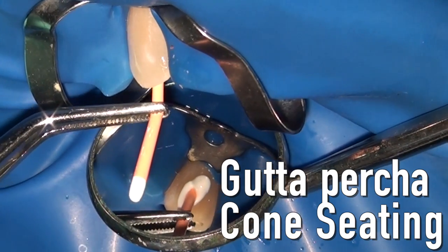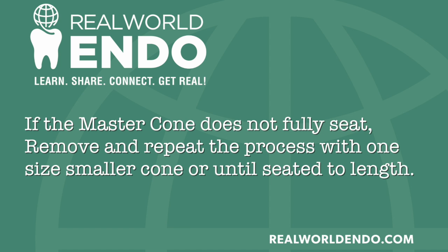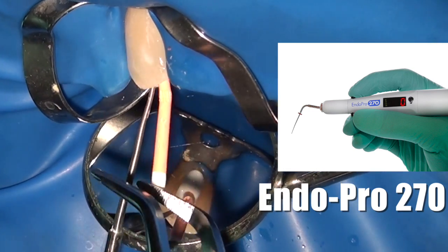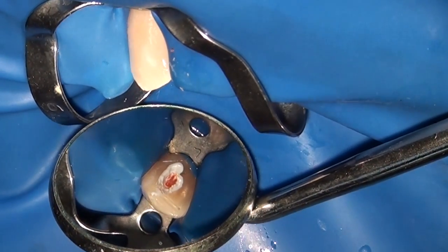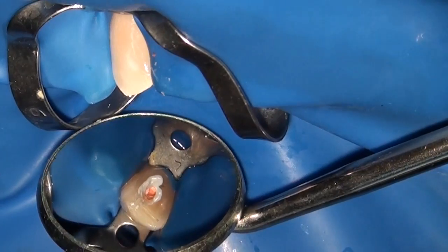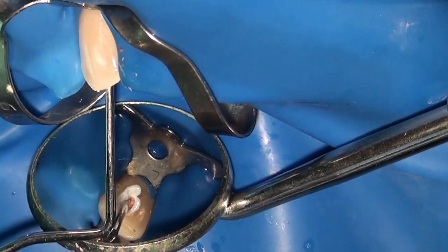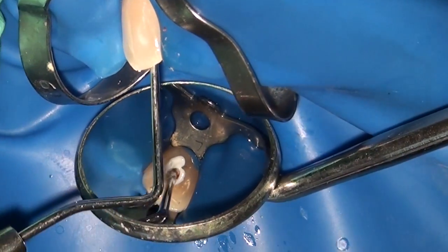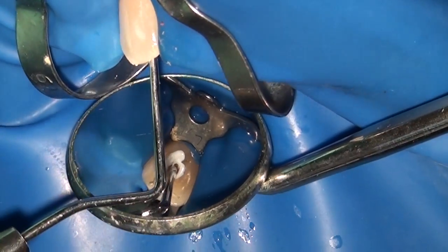Seat the coated gutta-percha cone, which has also been coated in sealer, all the way down — with the cone locked at the reference point, you can confirm full seating when it reaches that reference. Then use the Endo Pro 270 cordless heat source to sear off at the level of the orifice while the assistant holds and pulls off the handle, leaving molten gutta-percha in the chamber. Leave a millimeter or two of molten gutta-percha above the orifice, then use the largest plugger — size 10 — to condense the molten mass down into the orifice.